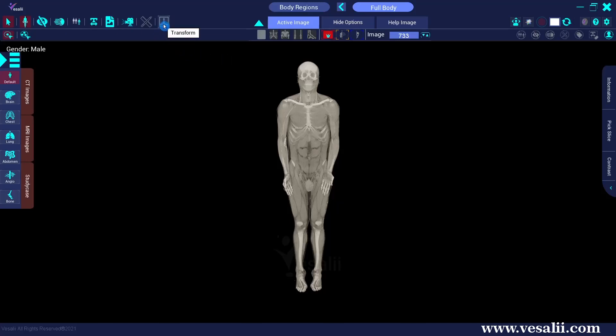The Transform tool allows the user to rotate the 3D radiology images in the scene in three axes. The default angle is set at zero degrees. Clicking on the plus button beside the axis will rotate the body 90 degrees for each click.